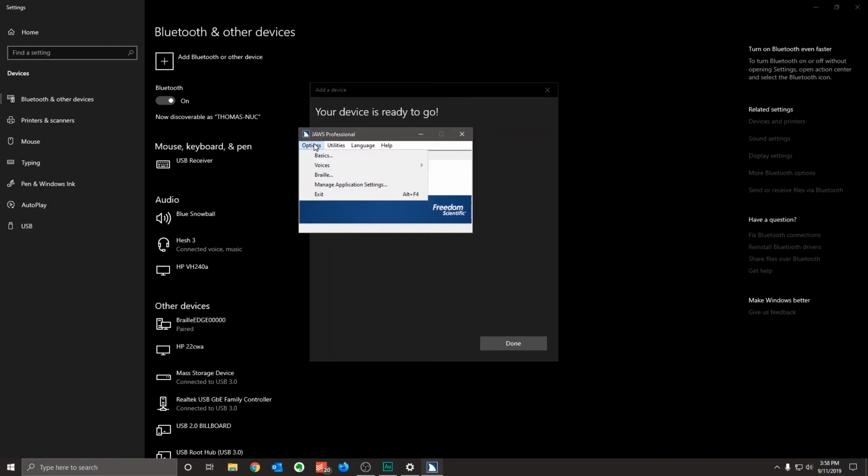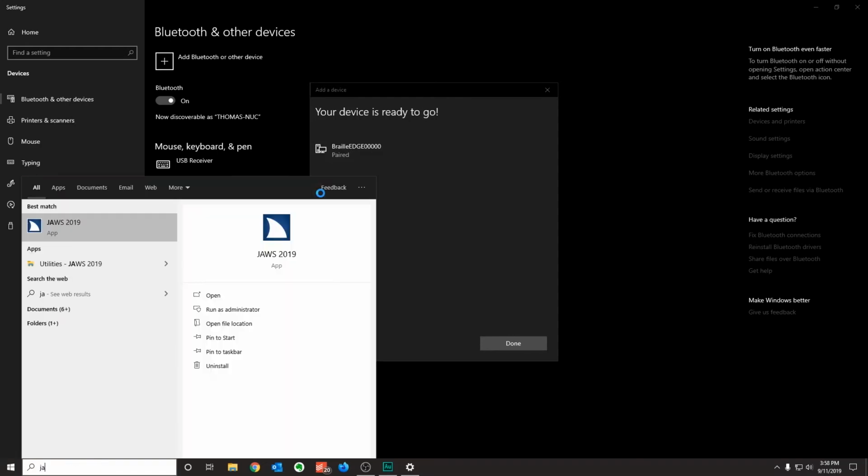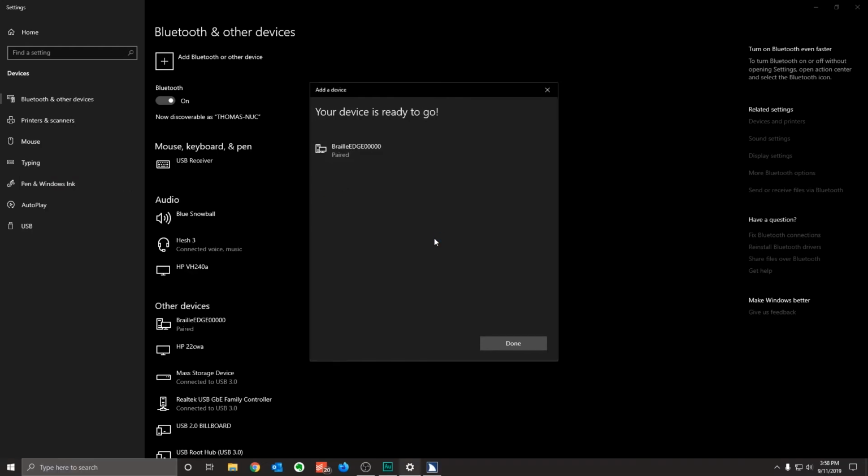Now, when I open JAWS this time, my QBraille should automatically connect to JAWS. I'm going to open JAWS again now by pressing the Windows key and typing JAWS, then hitting Enter. JAWS for Windows. Settings. Add a device. Your device is ready to go. Braille Edge 00000 paired. Done button. Next, let's set up the QWERTY keys to work so the QBraille can work in hybrid mode.